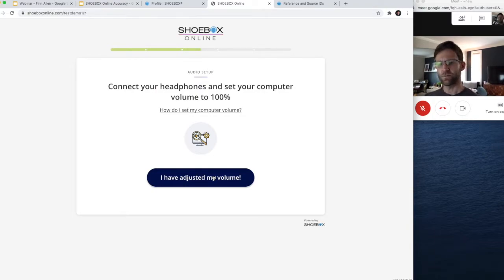We do reduce the volume of all the files that we play slightly to ensure that even with a max sound, we're not going to be getting anywhere near dangerous levels. You also have the added value of consumer electronics having max values, and they're all regulated by the FDA and the EU, so that really playing something too loud is not something that's going to happen.